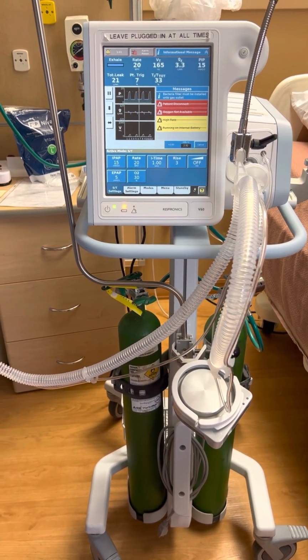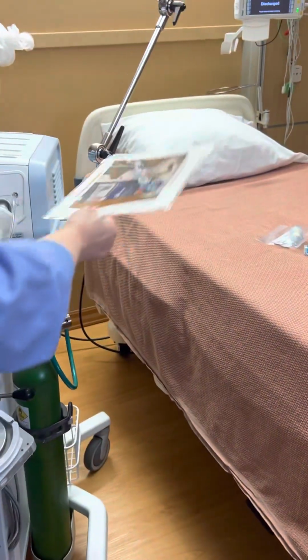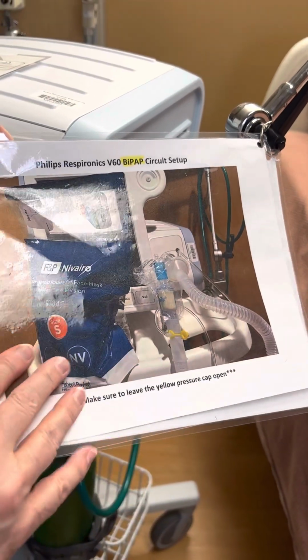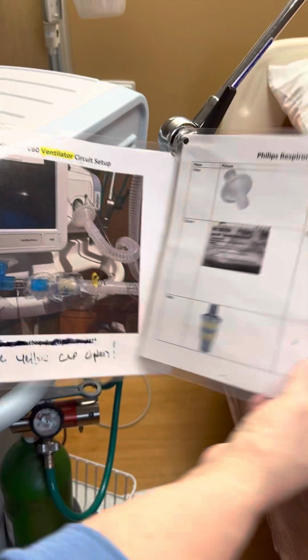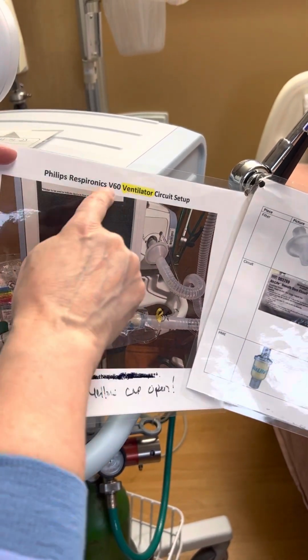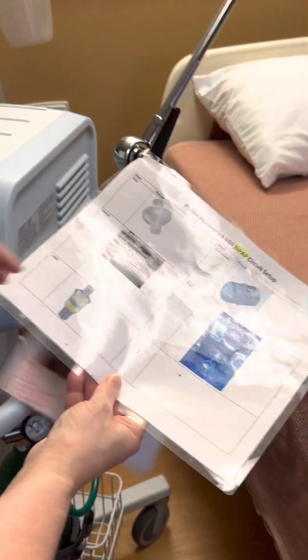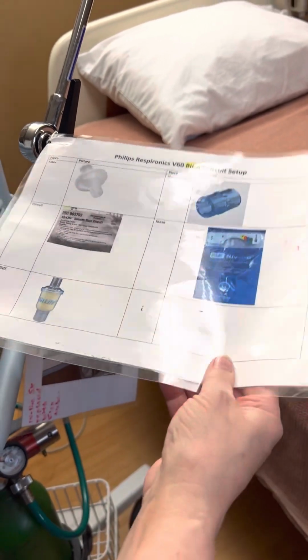Now, we can do inline nebs with this. So there are pictures, always remember, on the side here showing exactly how this needs to be set up. When COVID started, we didn't know if we'd need to use it as a pressure ventilator, so I did set it up as such, but it shows you inline nebs or if you'd ever have to use it as a pressure ventilator. We hope we never have to do that. On the back, the picture shows exactly the pieces you need to set this up. It's very easy.